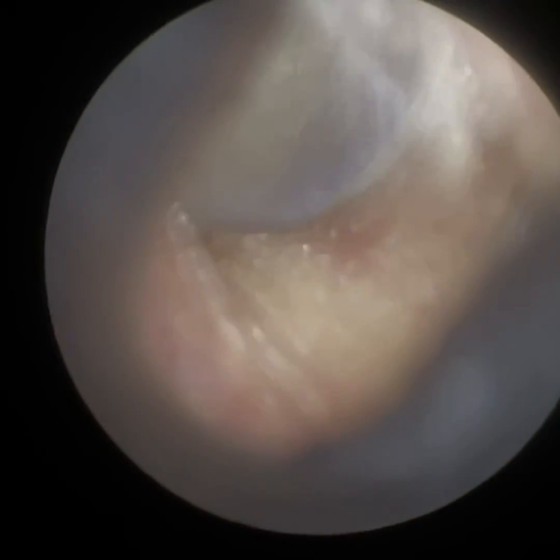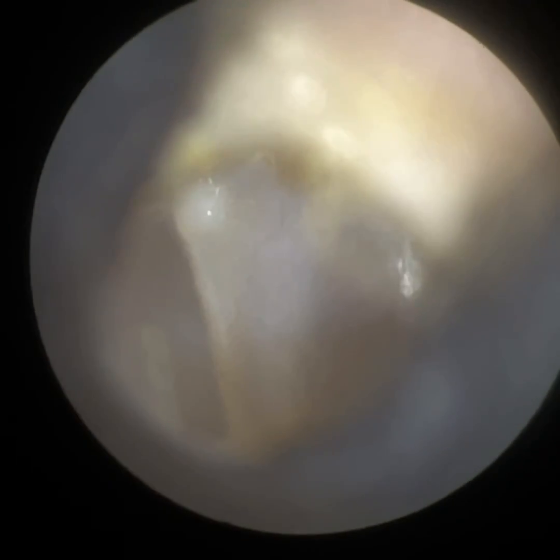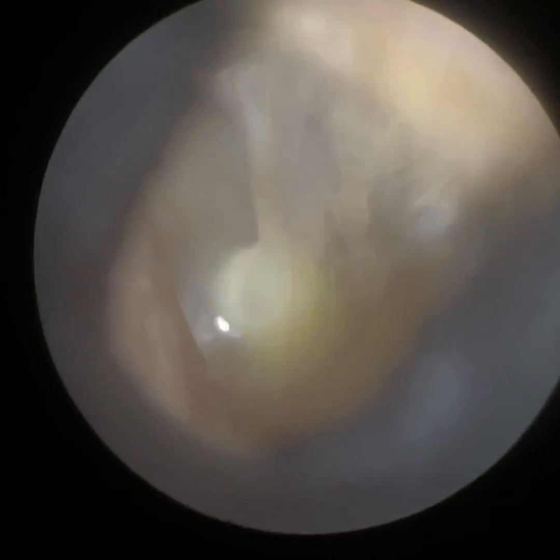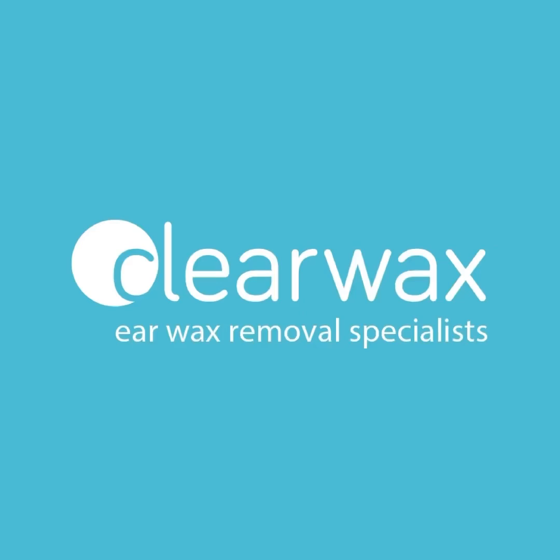We're now just going to dilate this patient's ear. You can see how small, narrow and constricted it is, but we've got a beautiful view of the eardrum there. You can see the handle of the malleus. The patient can hear significantly better. I hope you enjoyed that video, and if you are interested in the Waxscope, please do register your interest by emailing info@clearwax.co.uk. Thank you.